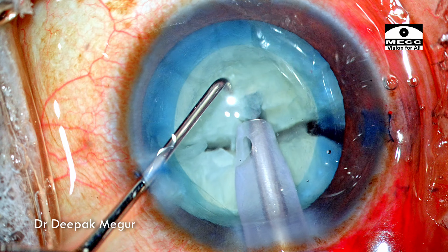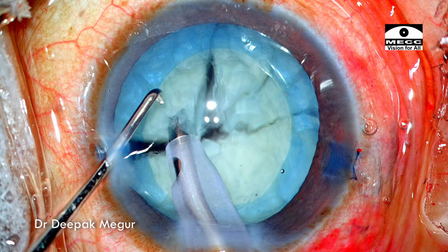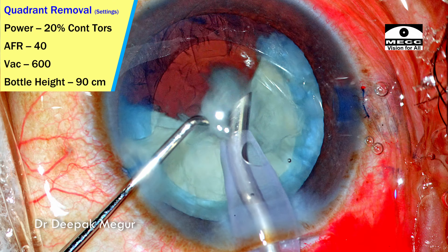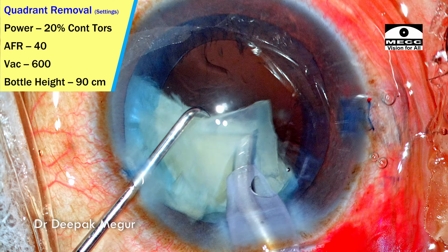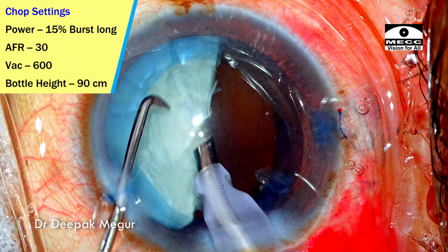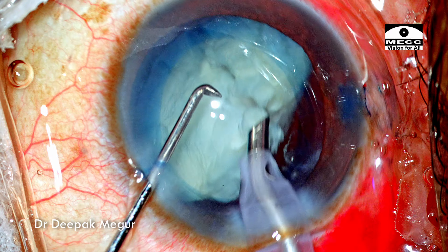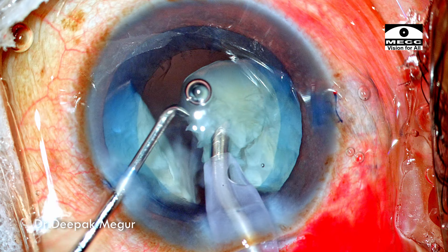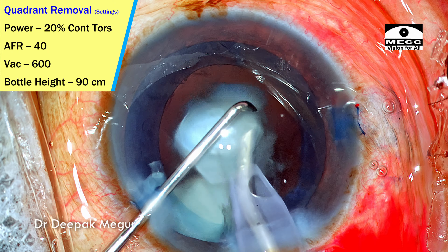The sharp vertical chopper goes in and then there's a lateral separation maneuver, giving us two hemi-nuclei. As expected, the nucleus is quite brittle and very easy to divide and separate. The first hemi-nucleus is divided into three pieces and each fragment is pulled out of the bag and emulsified at the level of the rhexis margin. The settings have changed for the quadrant removal mode, using just the torsional mode for emulsifying these quadrants. The remaining second hemi-nucleus is rotated and brought forward, and again divided into three smaller fragments using vertical chop maneuvers. During quadrant removal, the power is reduced to just 20%, which is good enough for this grade of cataract.